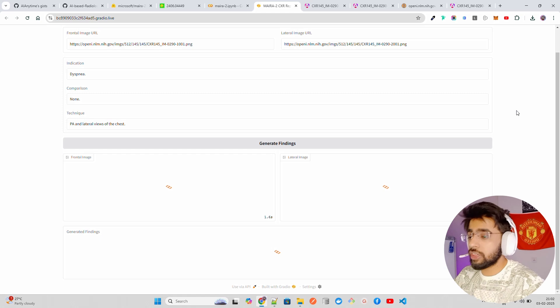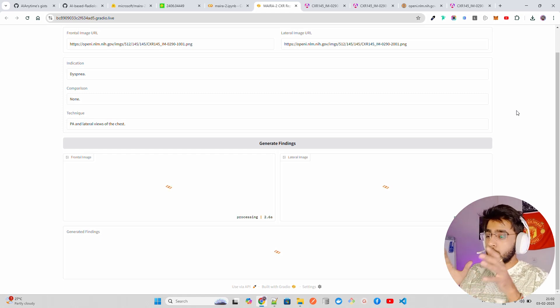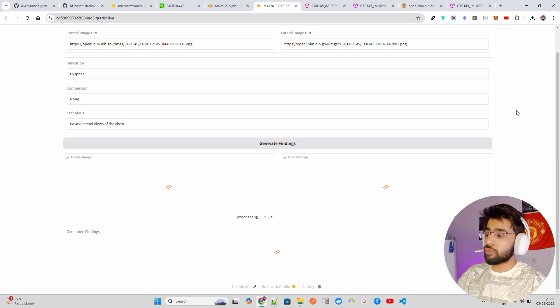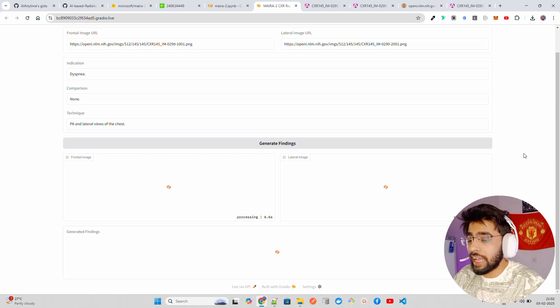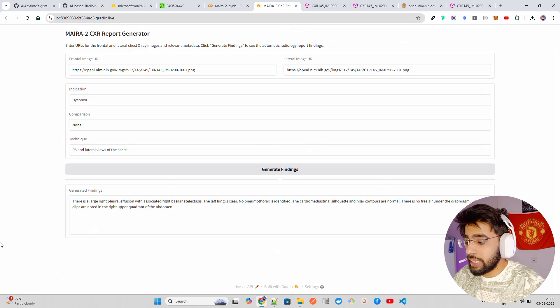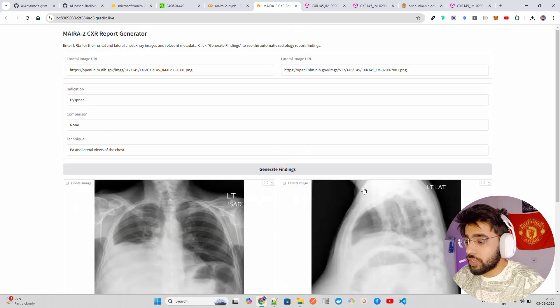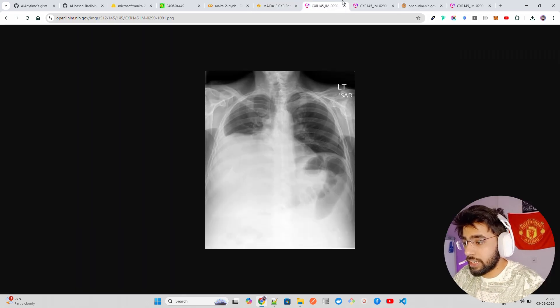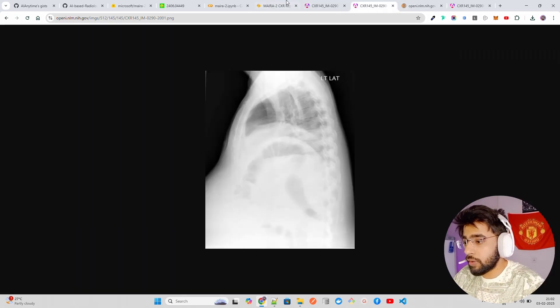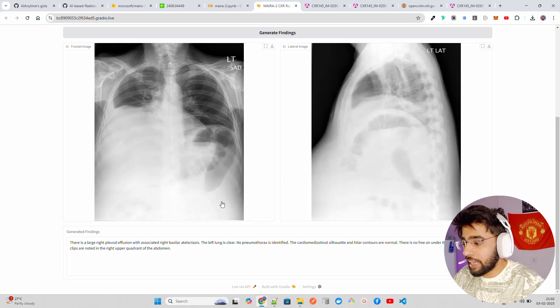When you click on the generate findings, it's going to show you the frontal image and the lateral image over here. Once you see it, it's going to generate a finding. You can see these are the images that we see over here as well, and we get this over here as well.